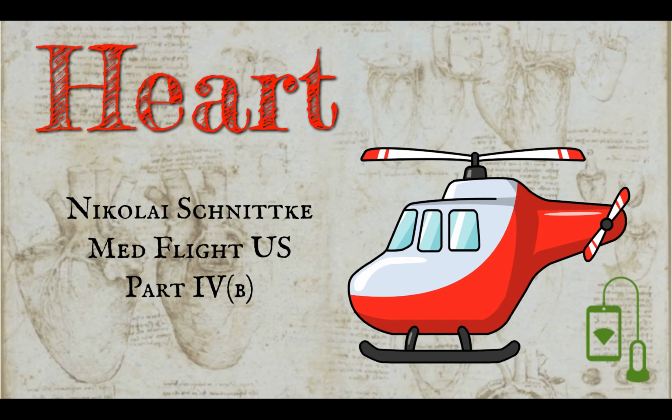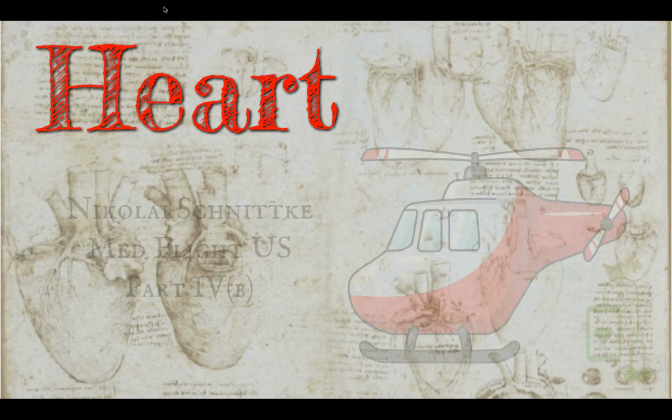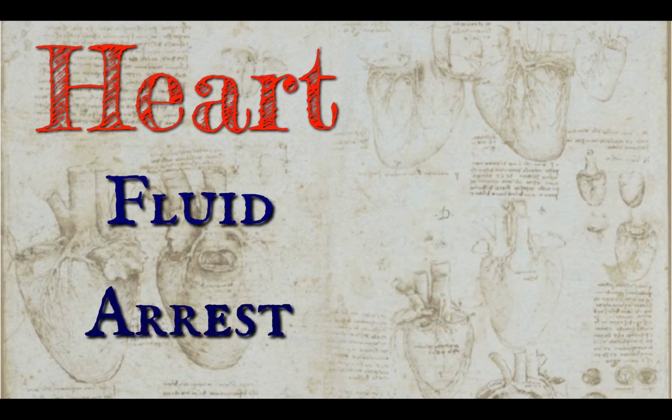Welcome to the second talk about looking at the chest. This time, we'll talk about looking at the heart. Obviously, echocardiography is a very complex field, but today we will talk about two key pieces of the emergency echo: identifying and interpreting pericardial fluid, and knowing what to do with cardiac views during cardiac arrest, which, as you will see, actually applies to any peri-arrest patient as well.